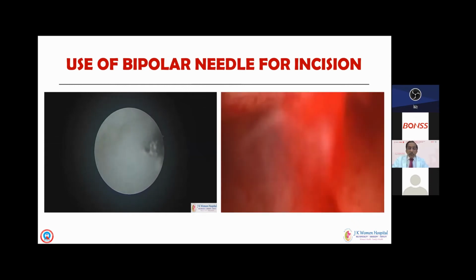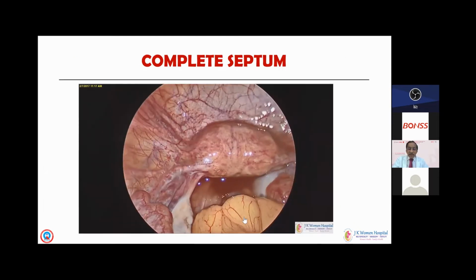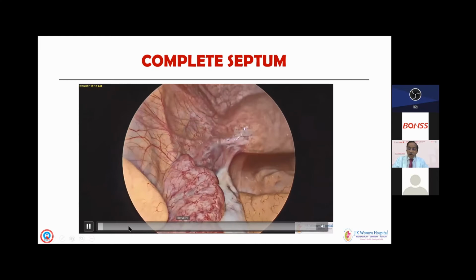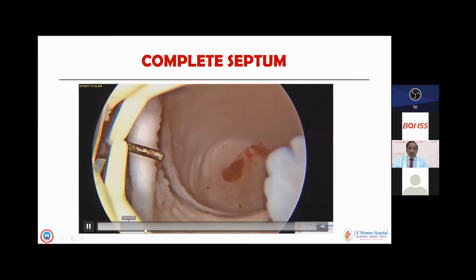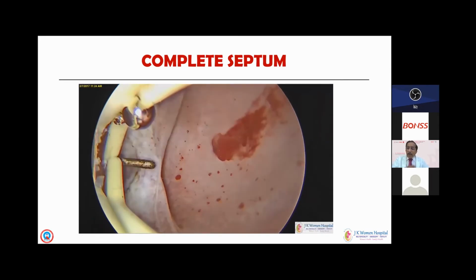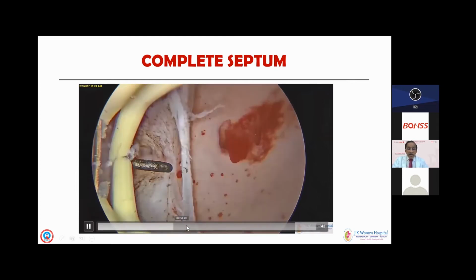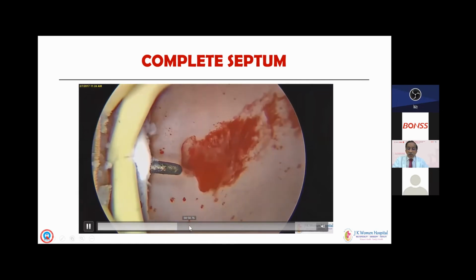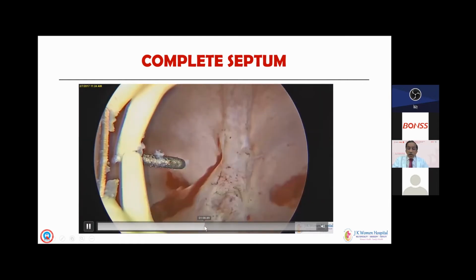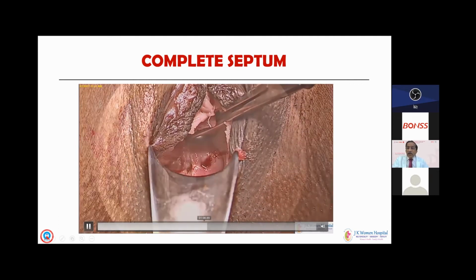Well, sometimes we do get a complete septum, as in this case where you can see the uterus fundus is absolutely normal. Sometimes we get patients who have a septum right from the vagina. So here we are seeing the technique of using the Collins knife for the vaginal septum. You can of course cut it with cold scissors here, but just for reducing the bleeding, this still is a good method. You can do the vaginoscopy way of cutting the septum inside the vagina, and you can see 2 ostia there, the cervical os is divided, and you can enter from one side of the cavity.